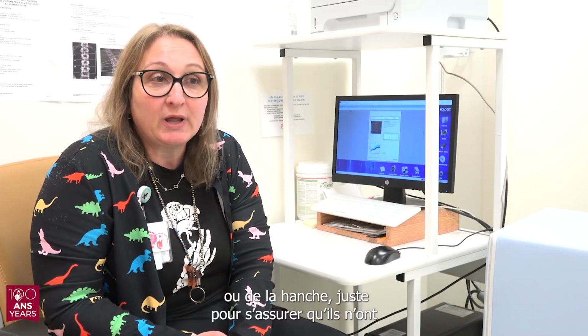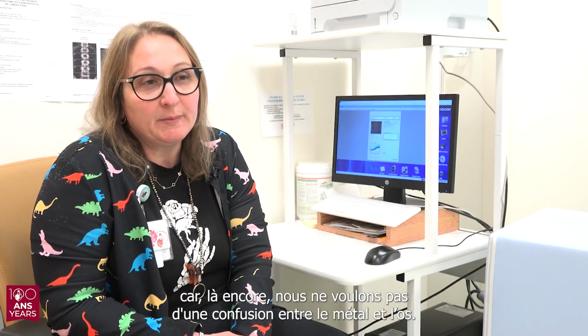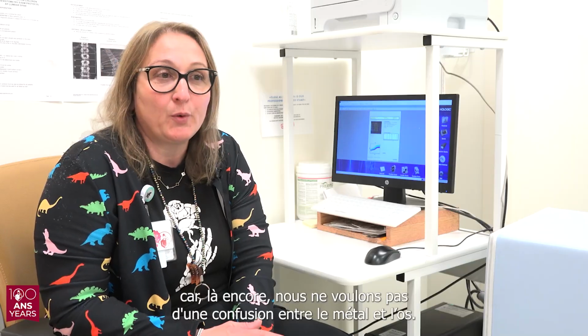Another question we ask is if they had spine surgery or hip surgery, just to rule out and make sure that they don't have metal in their back or their hips, so that, again, we're not mimicking the metal with bone.